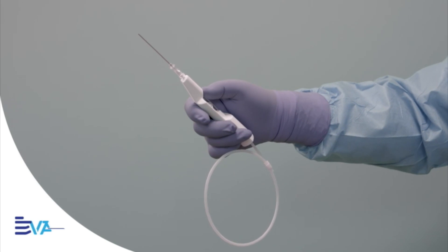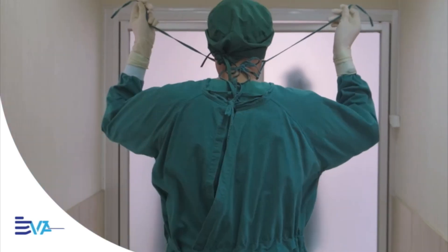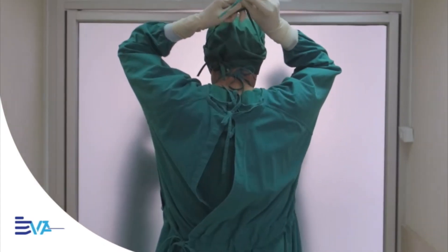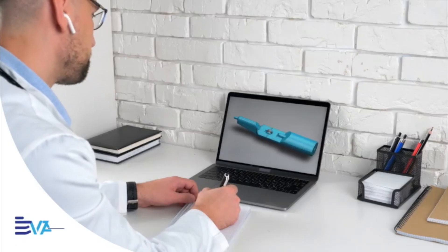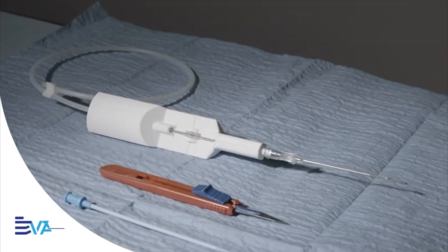No matter who you are — resident, attending, trauma surgeon or intensivist — there's always a moment of tension when placing a central line. But what if it didn't have to be that way? What if it could be fast, precise and stress-free?